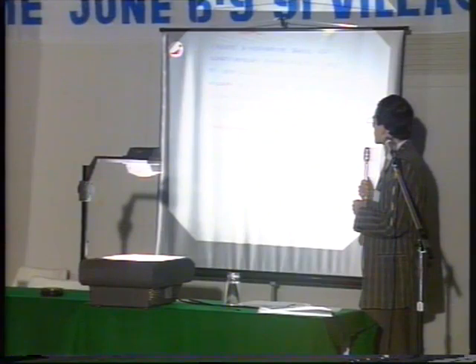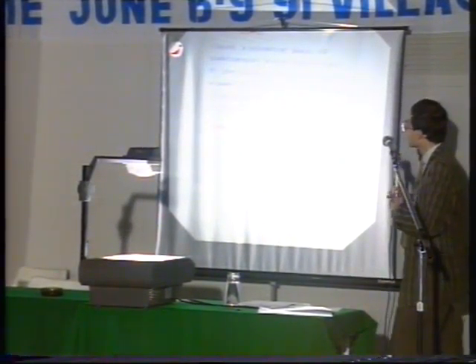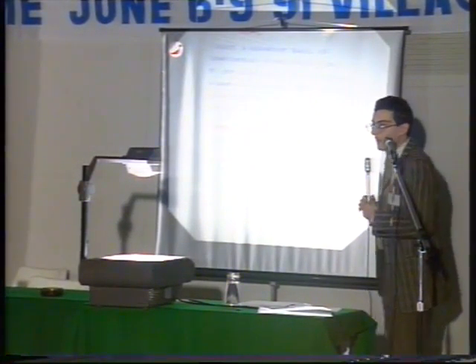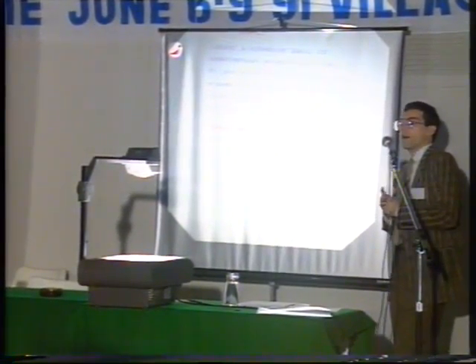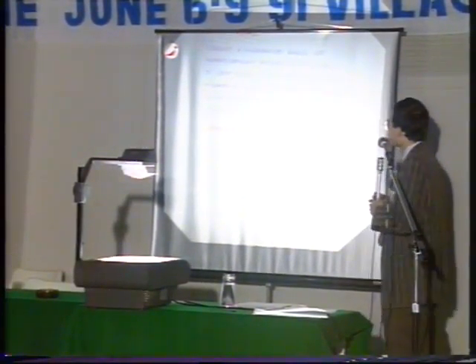So we decided to look at somatosensory evoked fields to left-right median nerve stimulation. What we did was to stimulate first, for instance, the left median nerve and then the right median nerve, to record the field coming from this stimulation and to perform field mapping and then source localization.